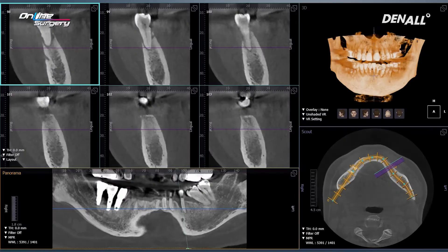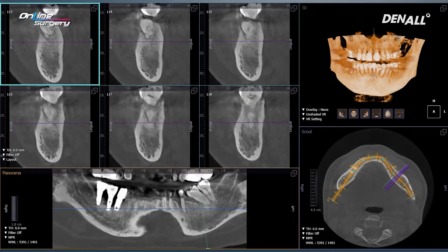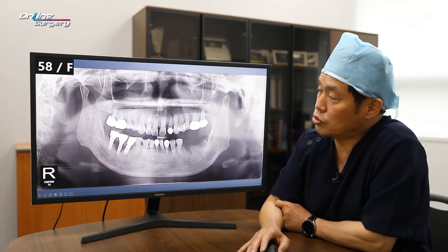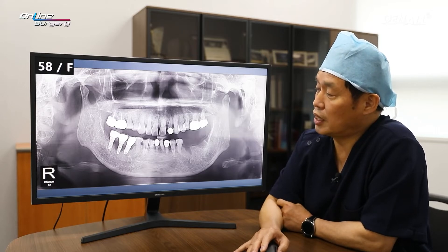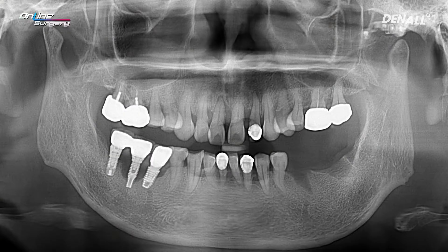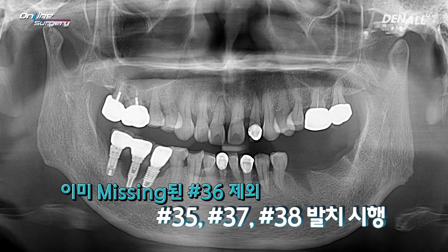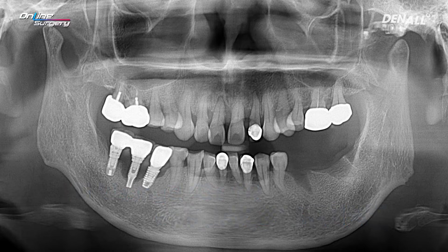Looking at CT, number five has significant alveolar bone resorption. Number six was missing. Number seven is tilted mesially with a lot of alveolar bone loss. The patient was in great pain, and at the initial visit, extraction was done in the lower left posterior area — number five, number seven which was tilted, and the wisdom tooth were extracted, apart from number six which was already missing.